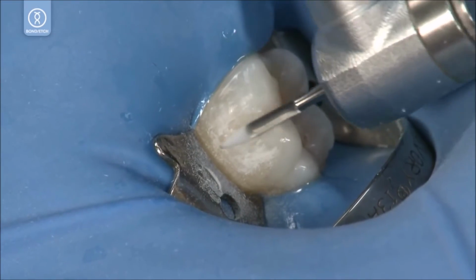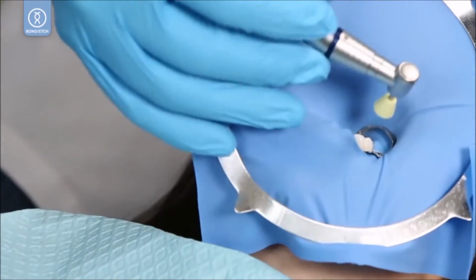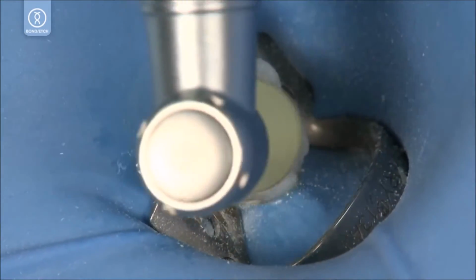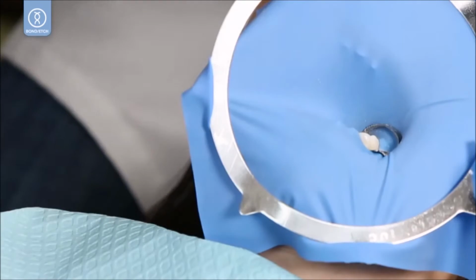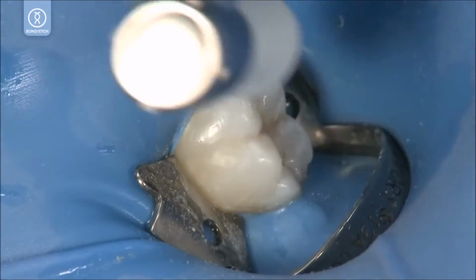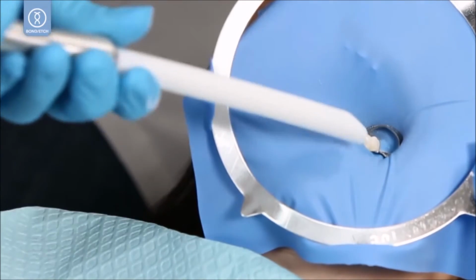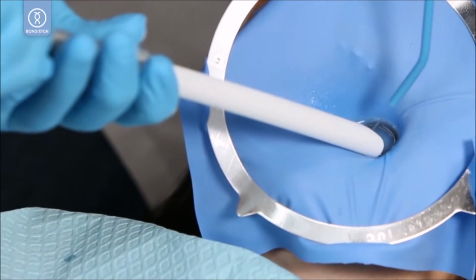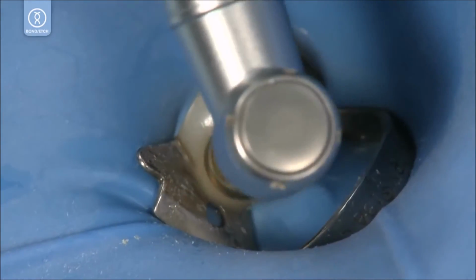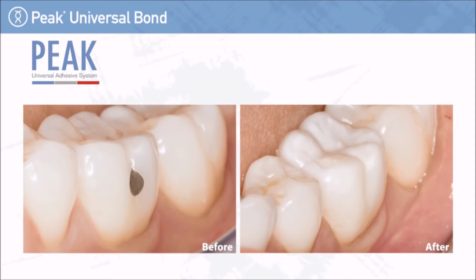Contour and finish the restoration with a carbide burr. Blend and polish irregularities with Jiffy polishers. Complete the polishing process with a Jiffy High Shine Polisher. Optional. Seal surface of the composite with PermaSeal.